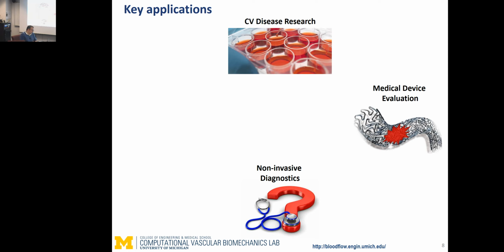This is actually the company of my previous advisor. When I was in grad school, we started developing these tools. He abandoned his tenured Stanford position and started this company, which almost 2 years ago received FDA approval for diagnosis of coronary disease. The idea is to use fluid-based simulation in this case to predict the severity of a stenosis.